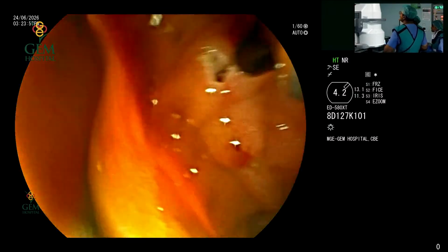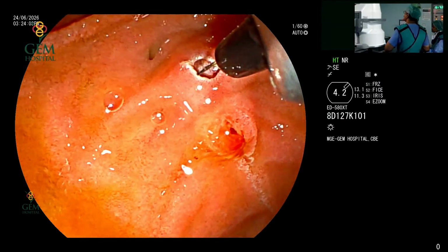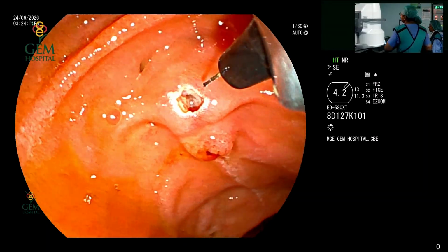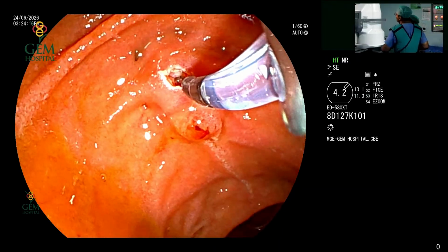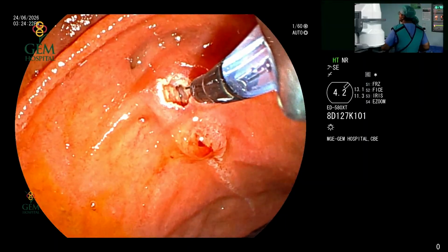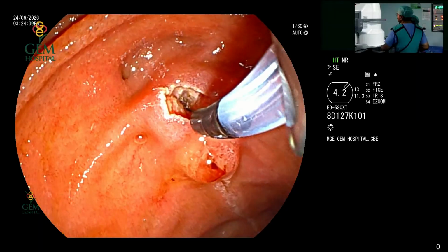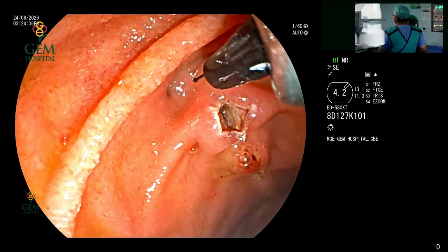As you cut the pre-cut access, you will first do it layer by layer without rushing. The most important structure you need to notice is the sphincter, which is tuna pink colored. As you pay more attention to it, you will notice this is the tuna pink you need to observe. As you get closer, you'll appreciate the sphincter and the tuna pink appearance of the bile duct. And you can sometimes see a gush of bile. Go layer by layer and do it much more patiently.